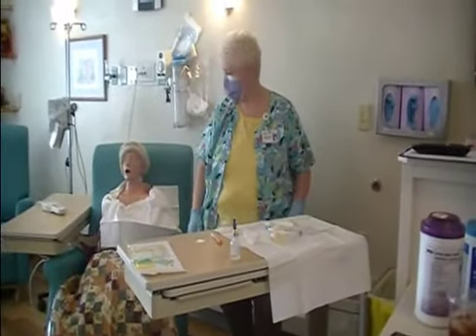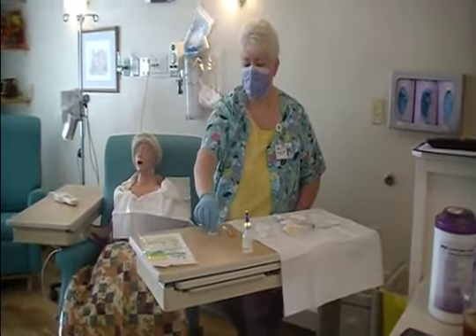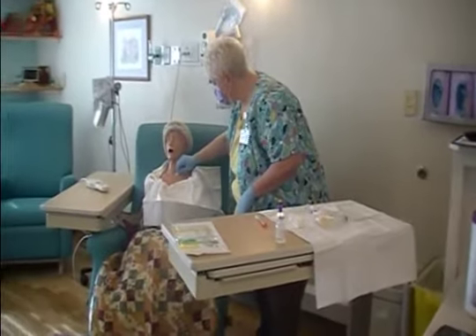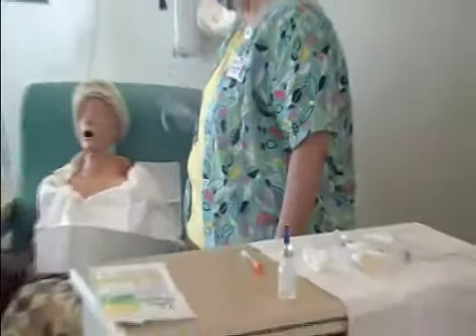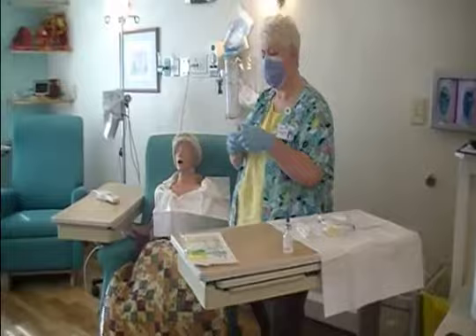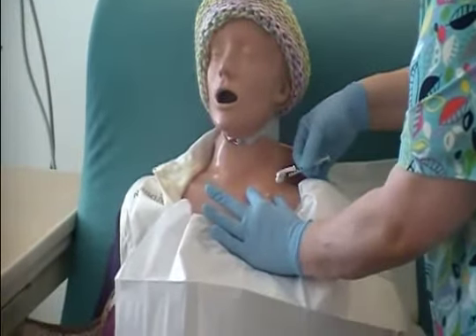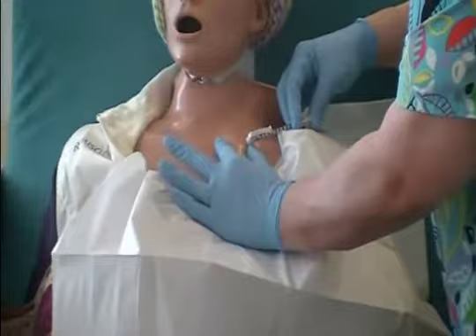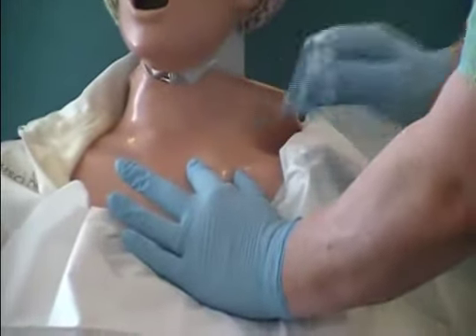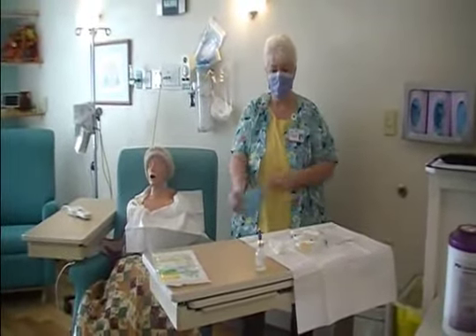So as you can tell, I've already palpated with clean hands the port and where it's at. I'm going to take an alcohol swab with clean gloves and scrub around the port really good, and then I'm going to let that dry. As soon as that gets dry, I'm going to take my insulin syringe with lidocaine in it — 0.5cc — and with my clean glove I'm going to go right in above that port, under the skin, and give that lidocaine, which usually leaves a little bubble there. And that's going to sit for a second while I change into my sterile gloves.